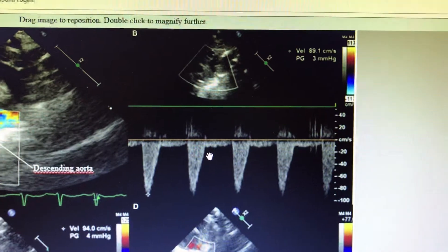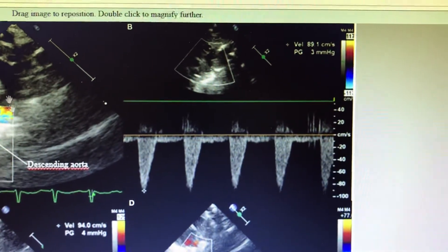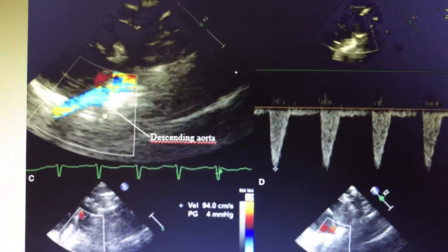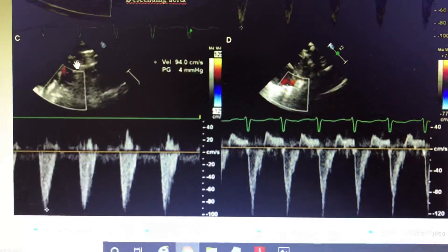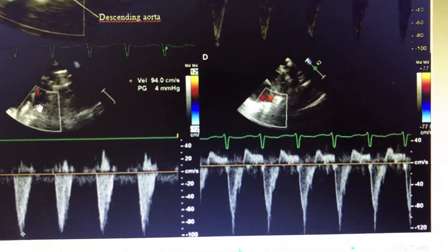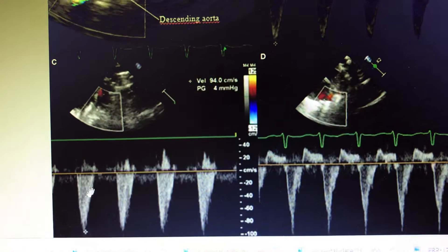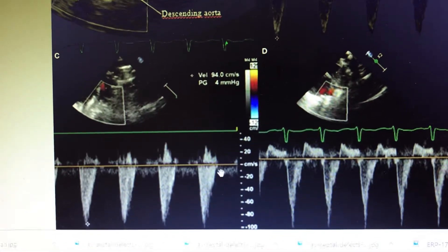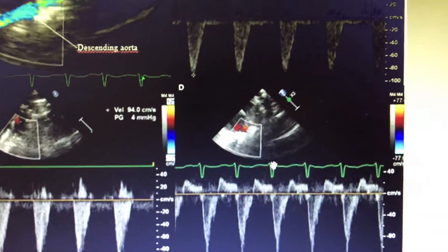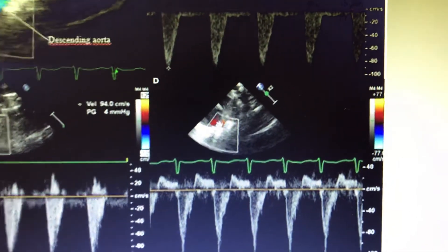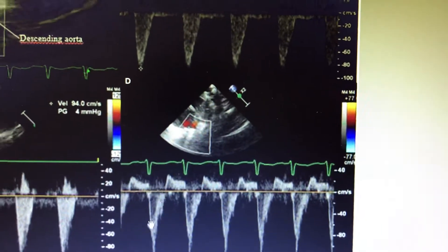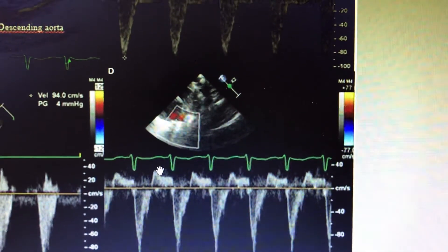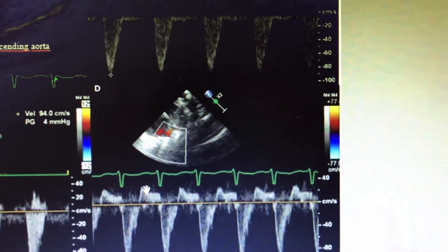So normally, when we place the cursor in the arch of the aorta proximal to the PDA, there is a forward flow in systole and forward flow in diastole also. But when you place the cursor in the descending aorta distal to the PDA, you can see that the systolic flow is present but there is little or no diastolic forward flow. However, in a severe, large, massive, or non-restrictive PDA, you can see systolic flow in the descending aorta and a beautiful reversal or retrograde flow back toward the arch of the aorta in diastole.